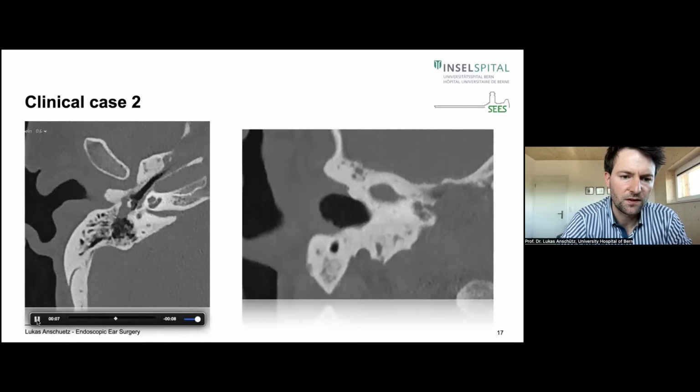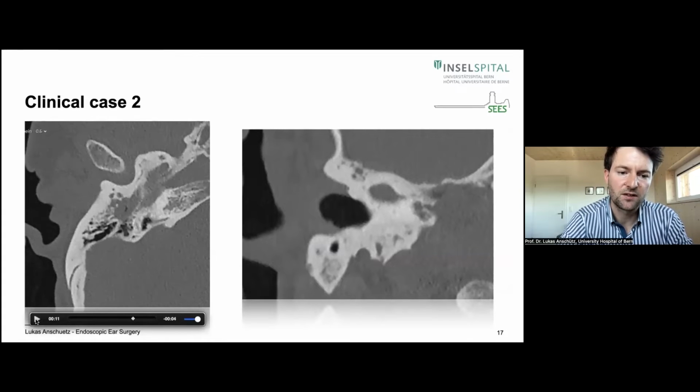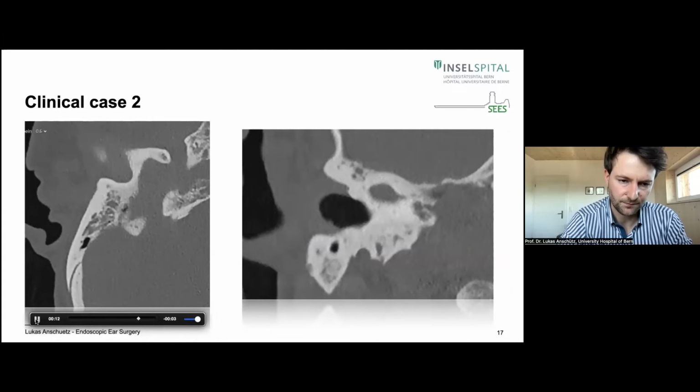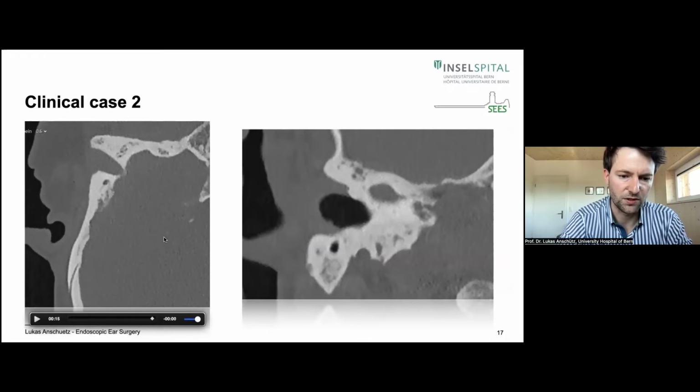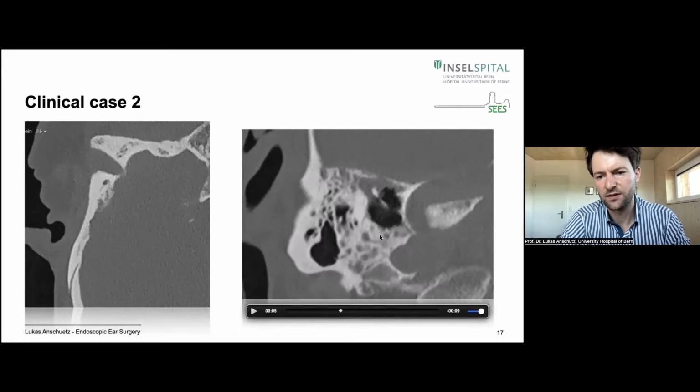So you can see here, again, probably this is the end of the cholesteatoma, and it reaches almost the end of the lateral canal. You can see here it goes even a bit more into the mastoid. So it's quite a limit of indication case. That's also why I want to show it to you. And if we look at the coronal scan, we can see a very similar view. You can see the middle ear is free, and here the cholesteatoma in the attic.